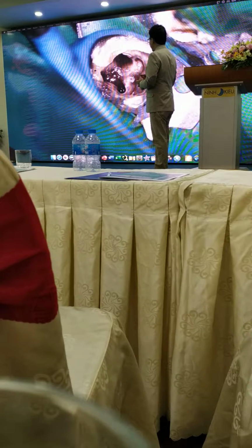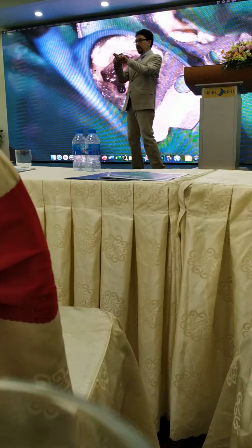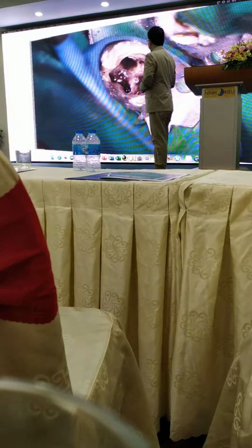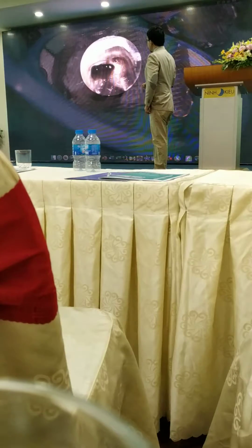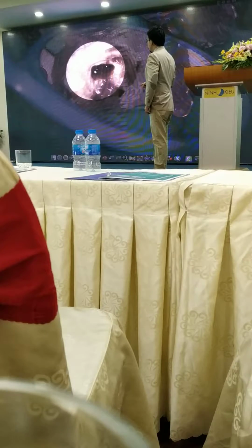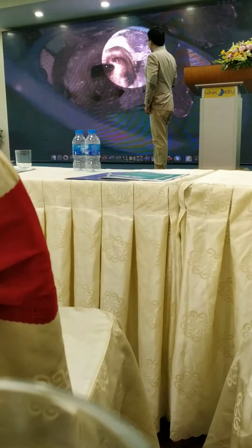We had in that case 2 mesial canals and 1 distal canal with a split, with 2 canals in the apical area. You can see here, we have 1 entrance, but we have 1 distal canal, distolingual, and 1 distobuccal canal here. And we need to replace this lost structure here.